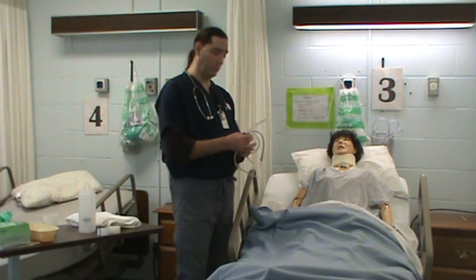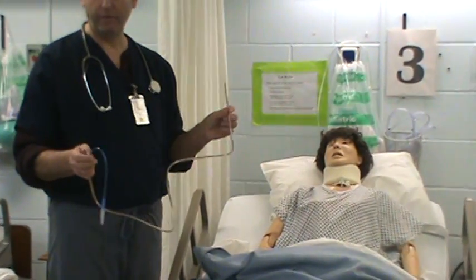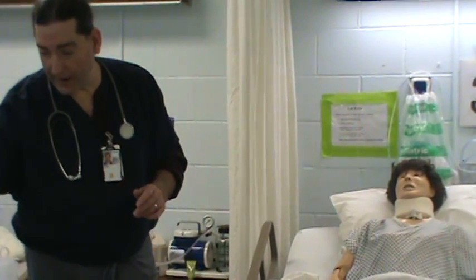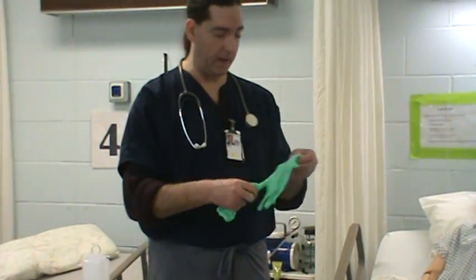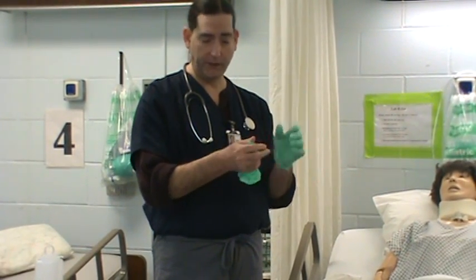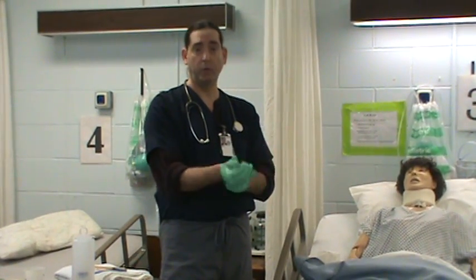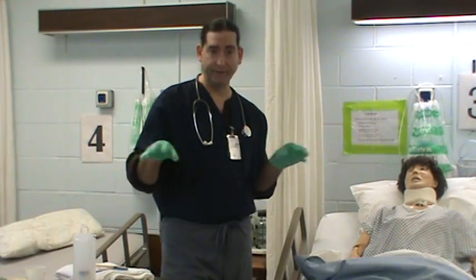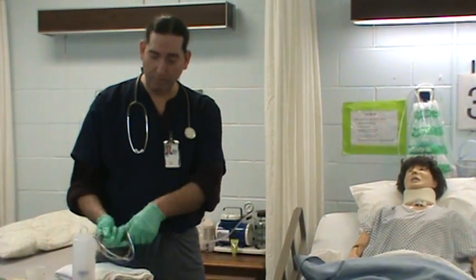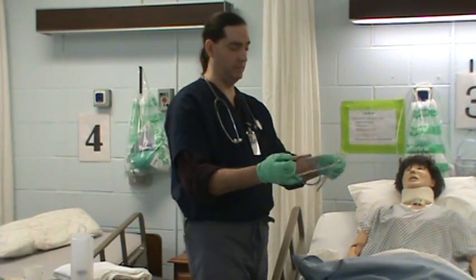Patient says okay. We've got a couple things to do to get ready. First, you have to know how far down you're going to put the tube. Before I open my packet, I get my gloves out and put gloves on. NG tube is a non-sterile procedure, but patients feel more comfortable if you've got gloves on when you're dealing with something that's going to go inside of them. Then I rip open my packaging and pull out the NG tube.